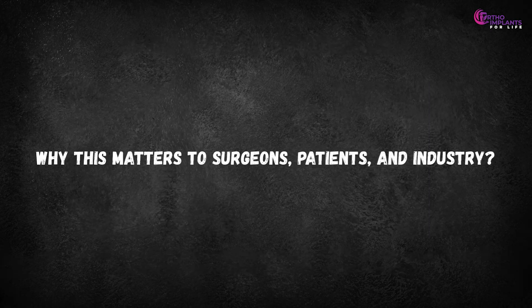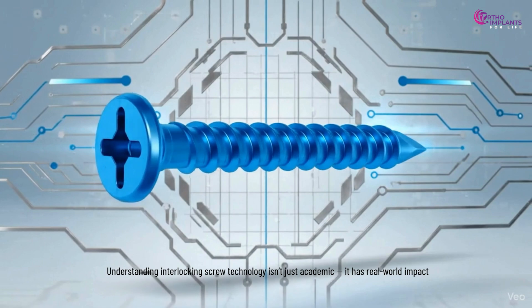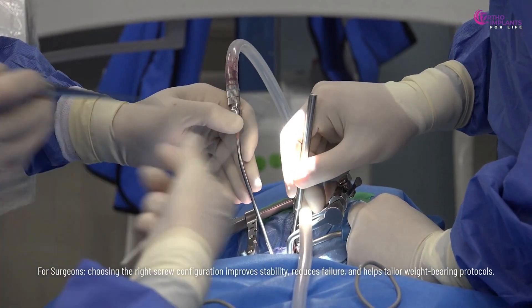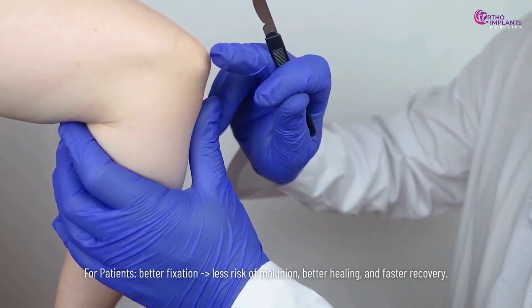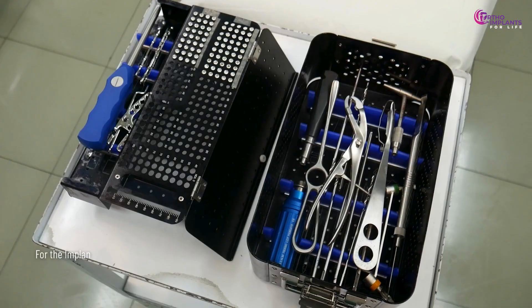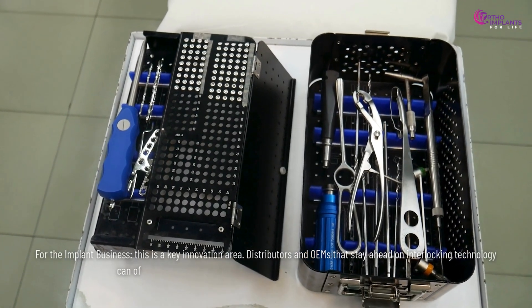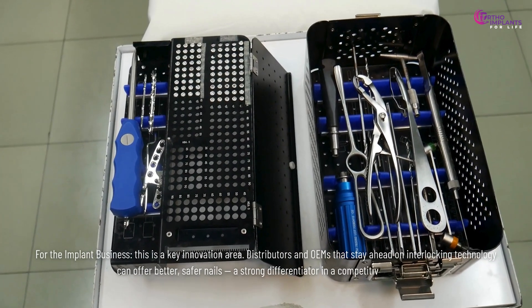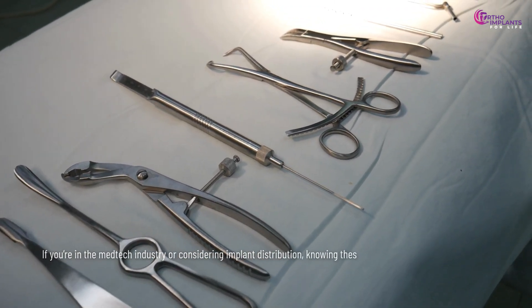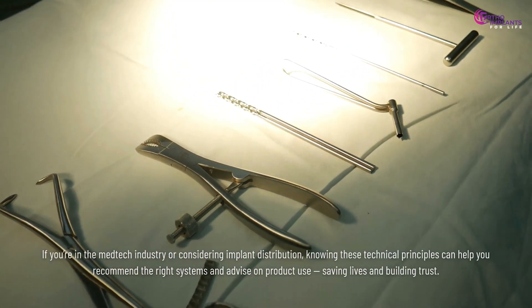Understanding interlocking screw technology isn't just academic — it has real-world impact. For surgeons, choosing the right screw configuration improves stability, reduces failure, and helps tailor weight-bearing protocols. For patients, better fixation means less risk of malunion, better healing, and faster recovery. For the implant business, this is a key innovation area: distributors and OEMs that stay ahead on interlocking technology can offer better, safer nails — a strong differentiator in a competitive market. Knowing these technical principles helps recommend the right systems, advise on product use, save lives, and build trust.